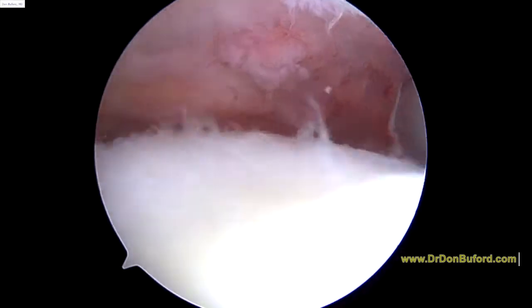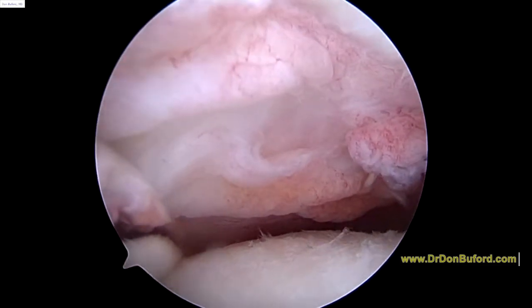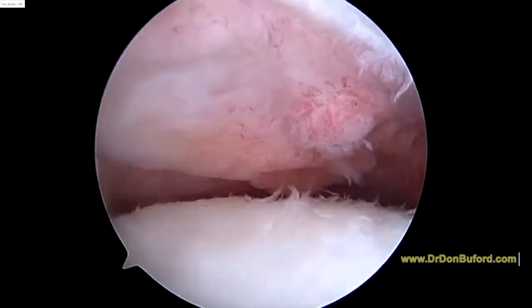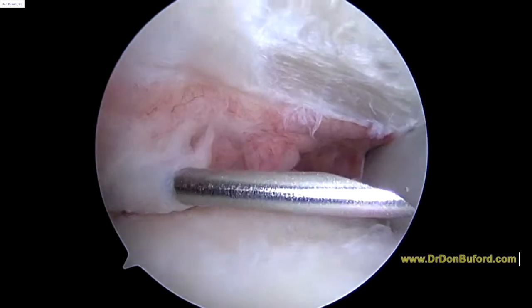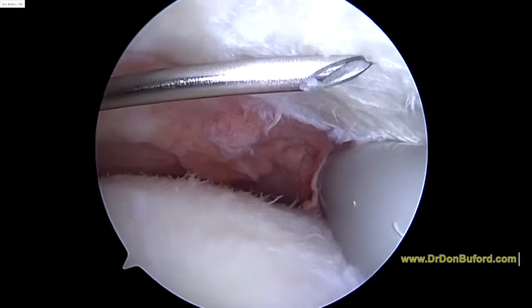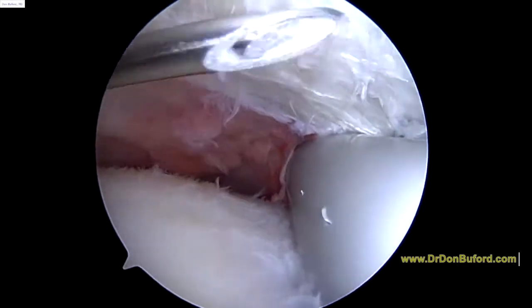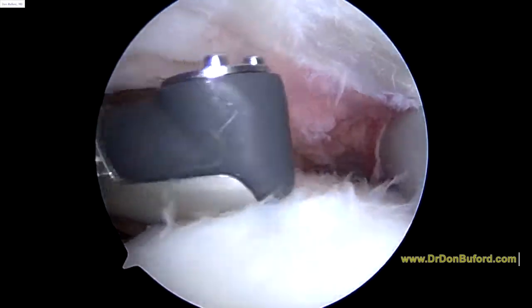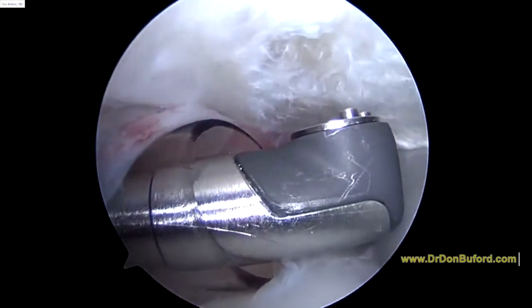So we're going to make another portal with a spinal needle. With our spinal needle coming in. Okay. And again, this is what I'm talking about. This is the undersurface of that coracoacromial ligament. Okay. Now we've got another cannula coming in from the left, which is lateral.